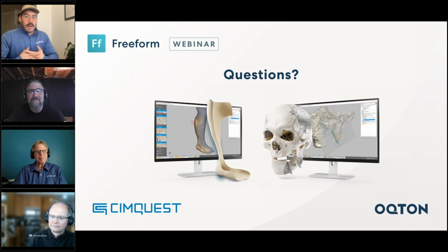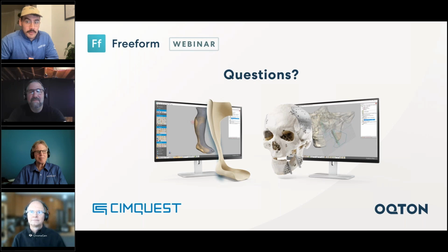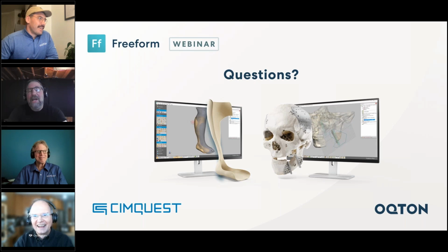Dave, you mentioned earlier in the presentation that many large healthcare companies are already using Freeform. Are there any that we can name and shame, if you like? I don't know off the top of my head who we have agreements with to actually specify.